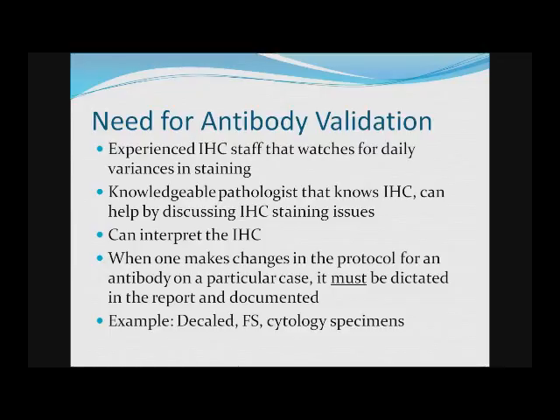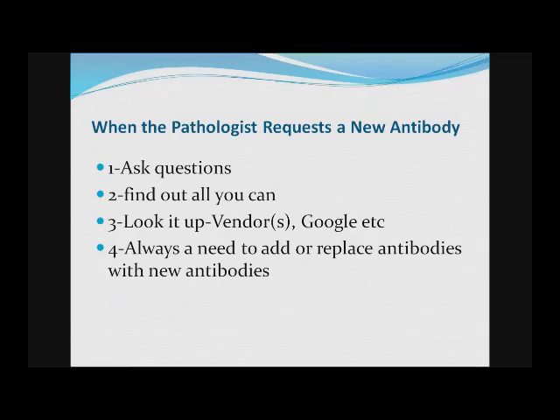When you make changes in the protocol for a particular case, you must dictate this in the report. And this could be a decal specimen, a frozen section, a cytology specimen. Things like that do need to be dictated in the report. And these are CAP requirements as well.